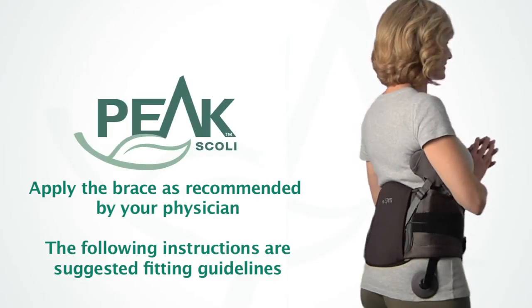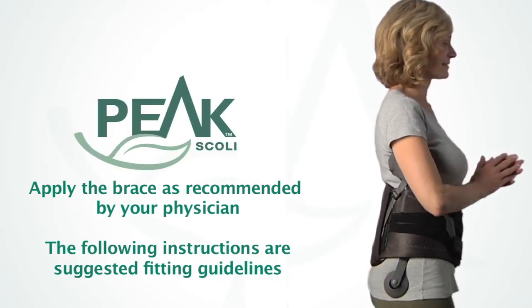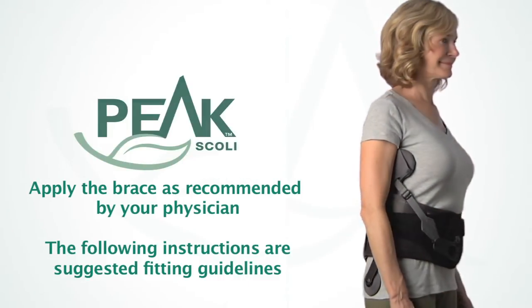Your Peak Scoliosis Bracing System has been adjusted to fit you. You should not need to adjust the brace further.